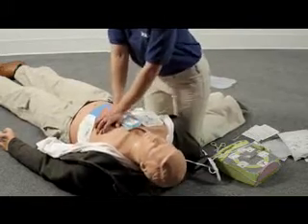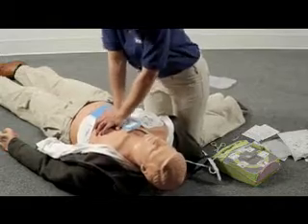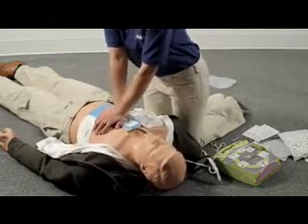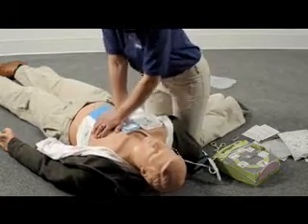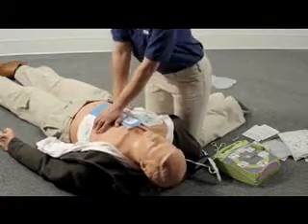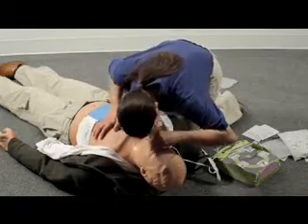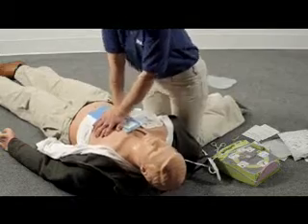Rescuers who lack the training or confidence to perform rescue breathing should perform continuous compressions without stopping. Compress the chest hard and fast 30 times, then give two breaths. After two minutes, you will have completed about five full cycles of 30 compressions and two breaths. Continue to follow the AED prompts.